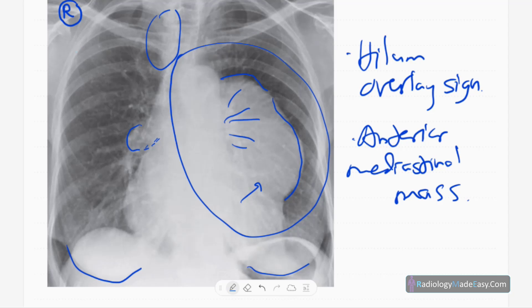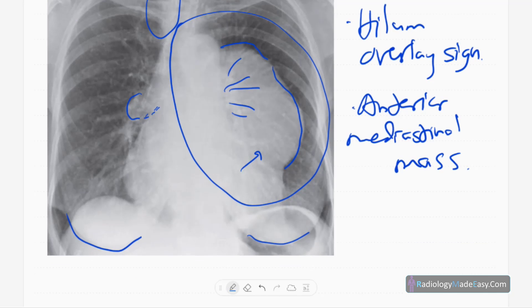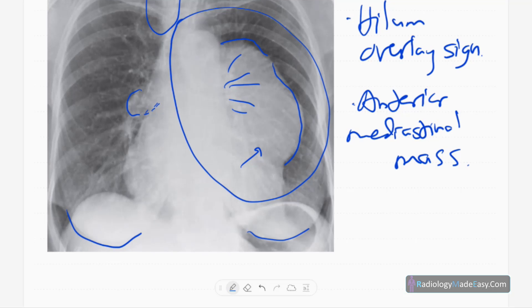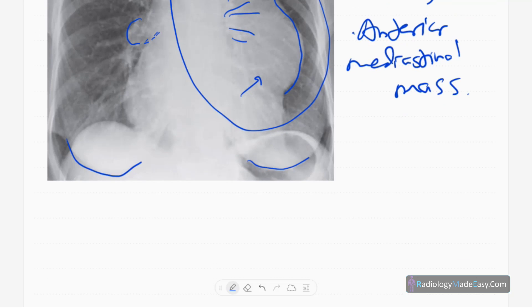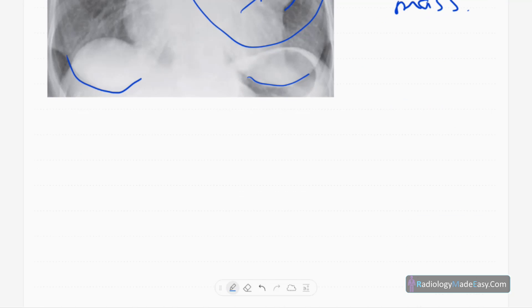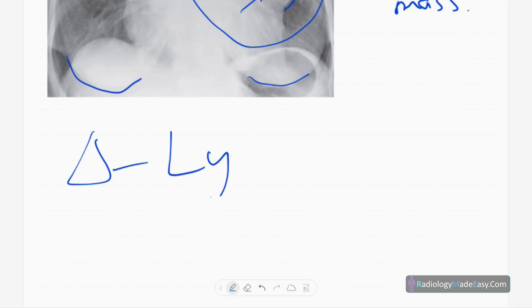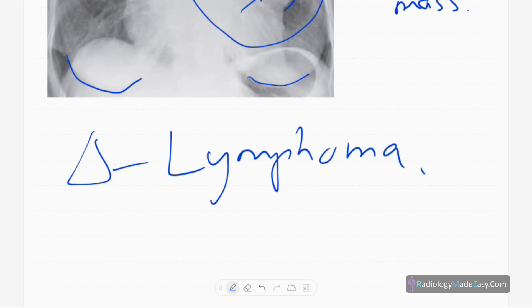There are no bilateral pleural effusions, no pneumothorax, and the visualized lung fields on the right side are normal. The diaphragm contours are also normal, and there is no obvious cardiomegaly.